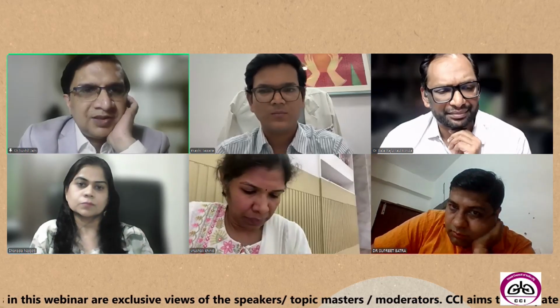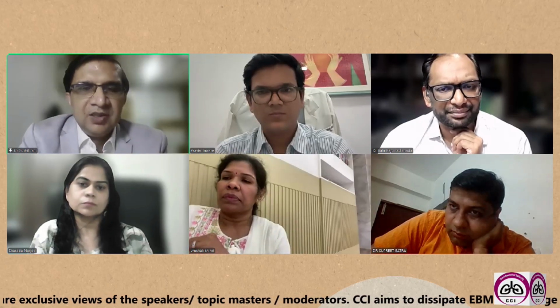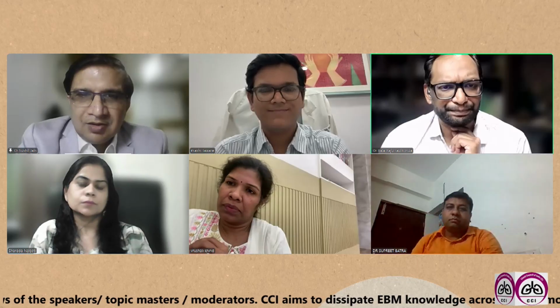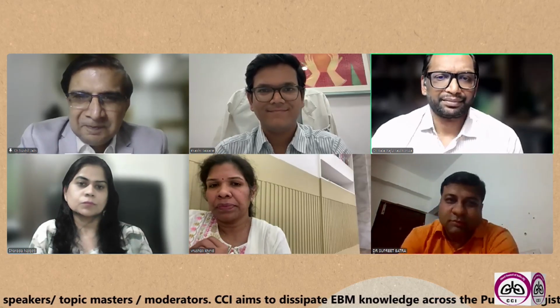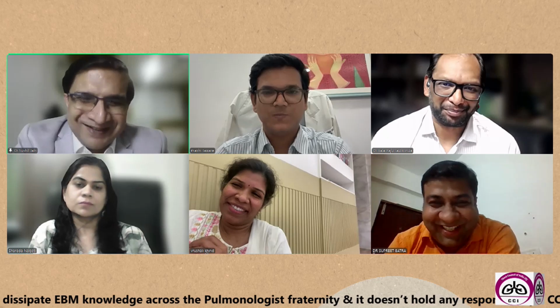Because if you use too much suction, then you can also get a bloody sample. That's another problem. So I think we close the session of today. Dr. Supreet, anything you want to add today? No, nothing, sir. Everything is done. But the only thing is, last point, suction versus no suction: no data. I think the studies have not shown that any of them is beneficial. So it's your individual practice which matters.